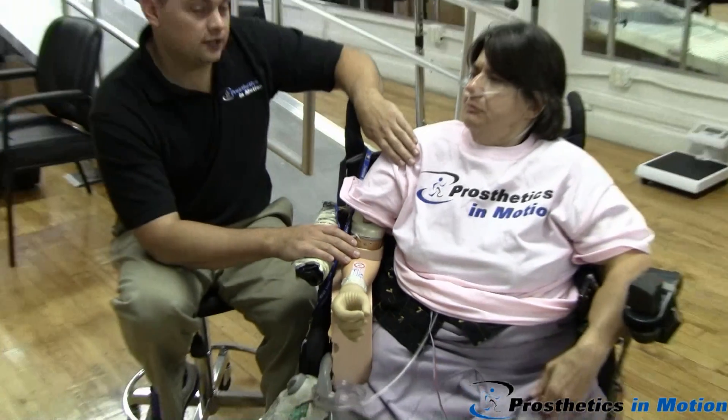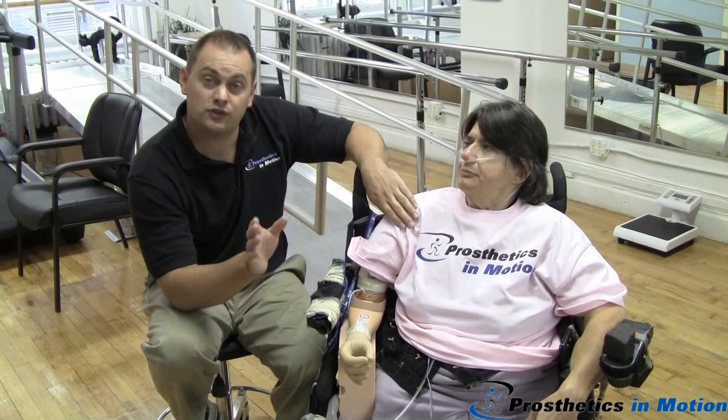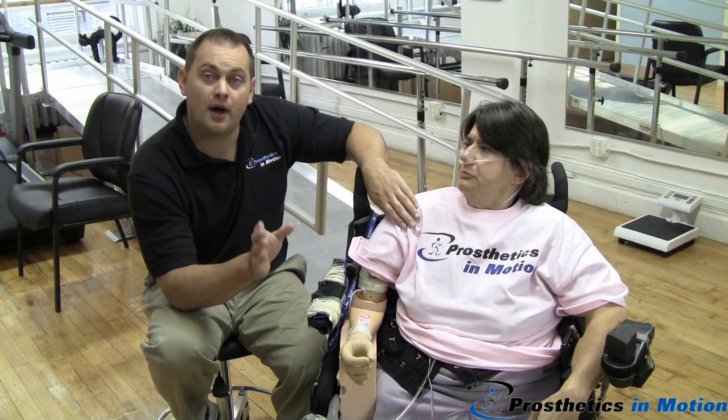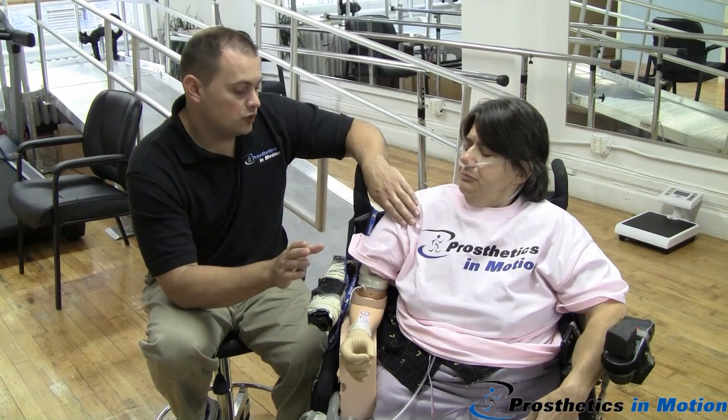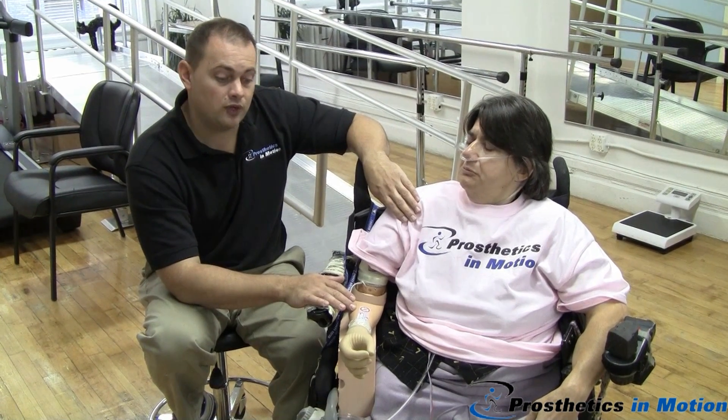This is Tex's first prosthesis in 40 years. Her last prosthesis 40 years ago was a body-powered device. She's doing extremely well, and she's going to demonstrate how she can operate the prosthesis.